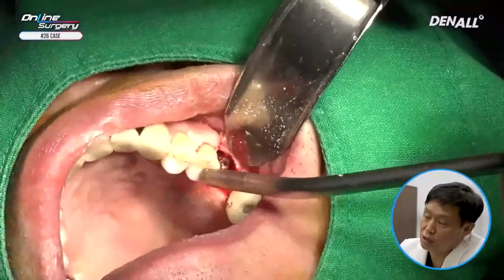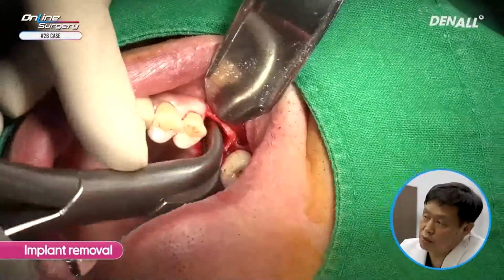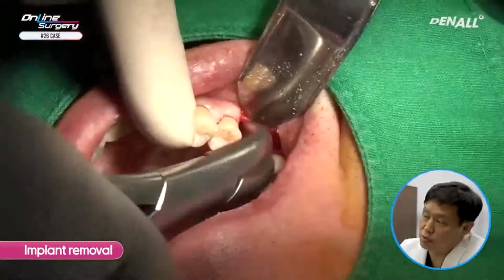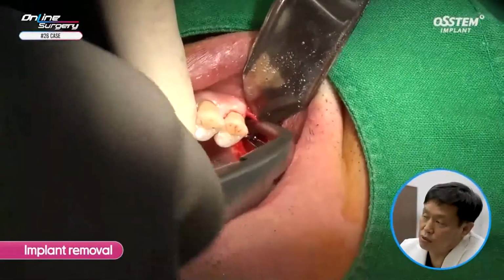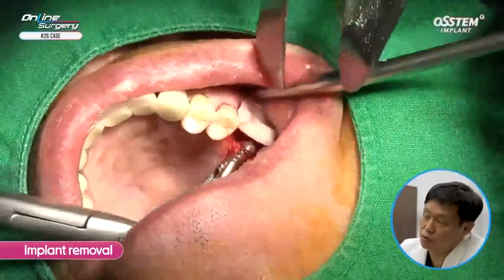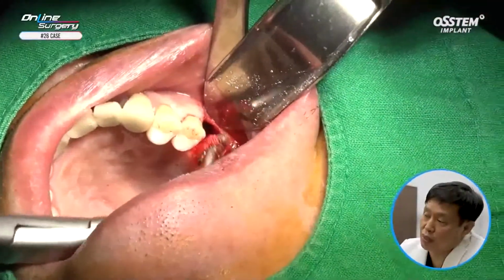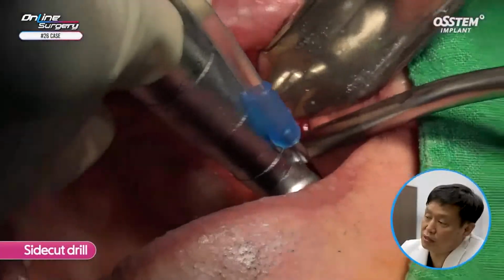Once it's moving, I'm going to use the forceps to remove the implant. It's quite nicely osseointegrated. I'm now removing the implant. Fortunately, I was able to remove the implant without damaging the buccal plate. As mentioned earlier, there was a significant palatal bone.